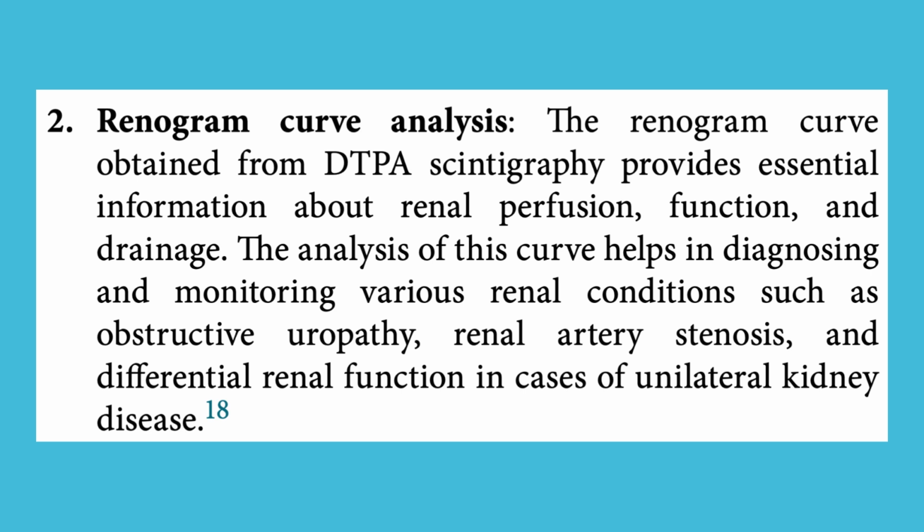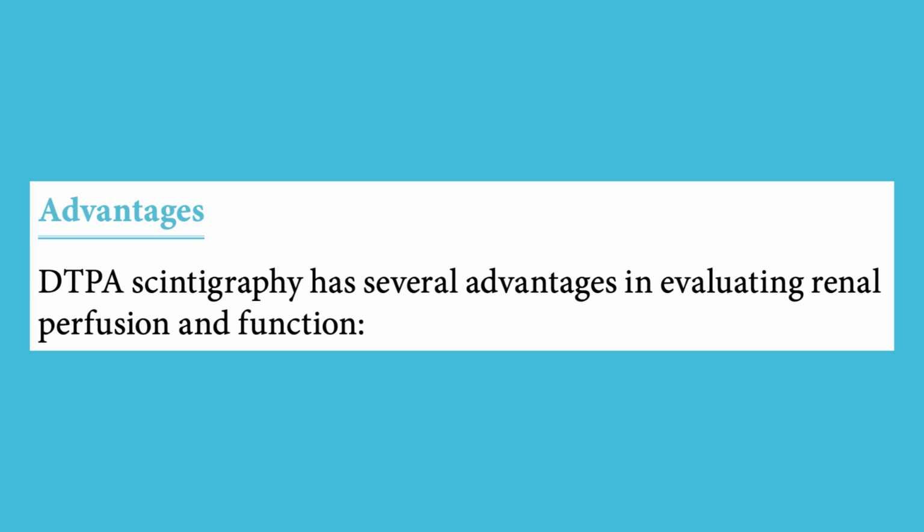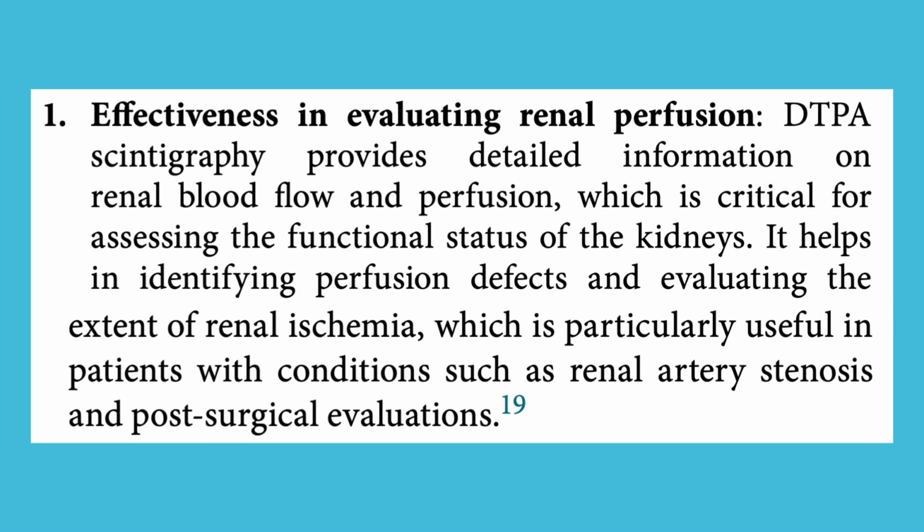The renogram curve obtained from DTPA scintigraphy provides essential information about renal perfusion, function, and drainage. The analysis of this curve helps in diagnosing and monitoring various renal conditions such as obstructive uropathy, renal artery stenosis, and differential renal function in cases of unilateral kidney disease. Advantages. DTPA scintigraphy has several advantages in evaluating renal perfusion and function.